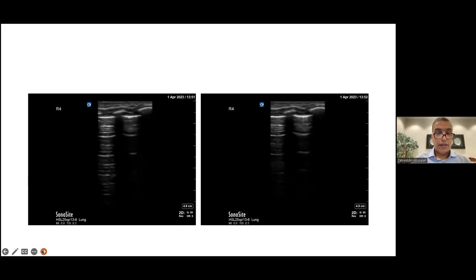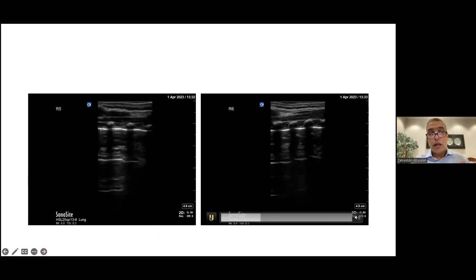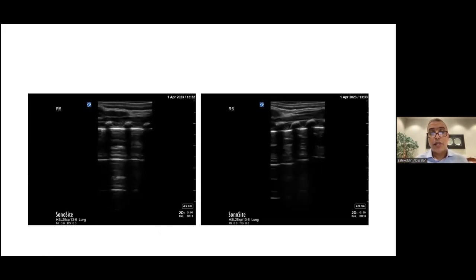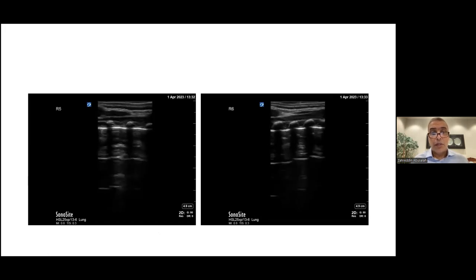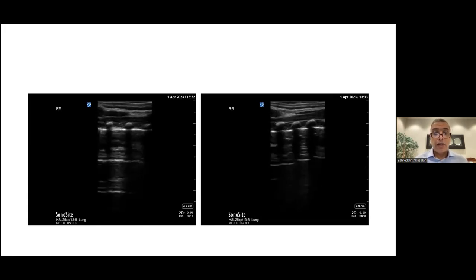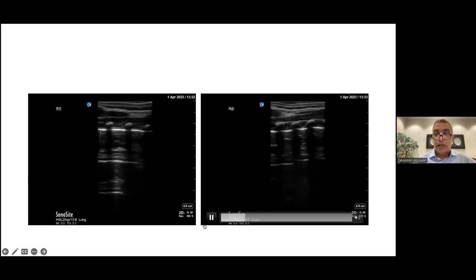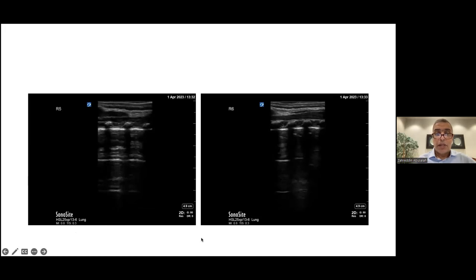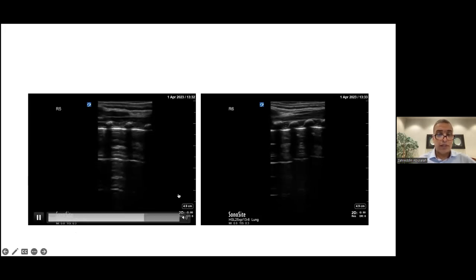Yeah. Then moving on to the back, please note that I did the R5 and R6, or the posterior views, on the right and the left first, because he was on his tummy, in a prone position, when I started doing the scan, and has been for a while. So these are the first images to be done. Just for the sake of the presentation, I went in the systematic way. So again, R5 and R6 showing pretty much predominantly A profile with normal pleural sliding with some comet tails, but no other abnormalities.